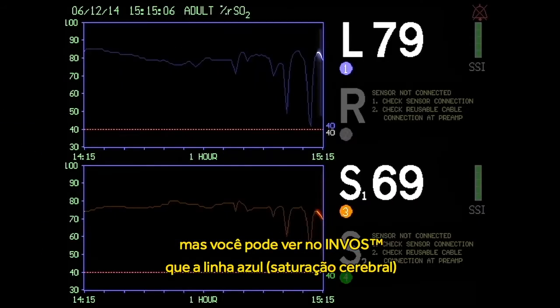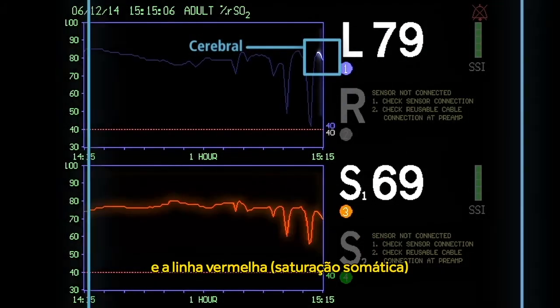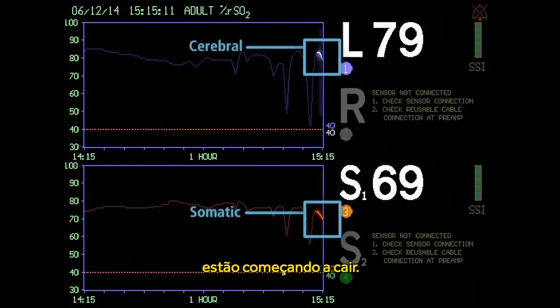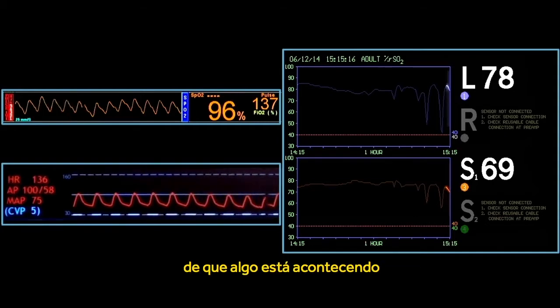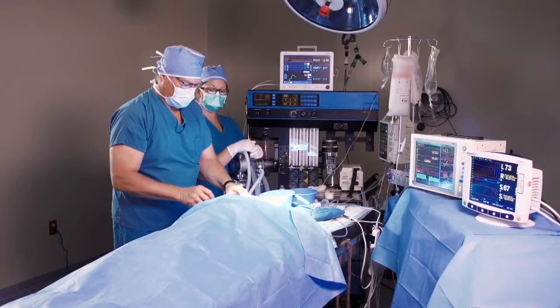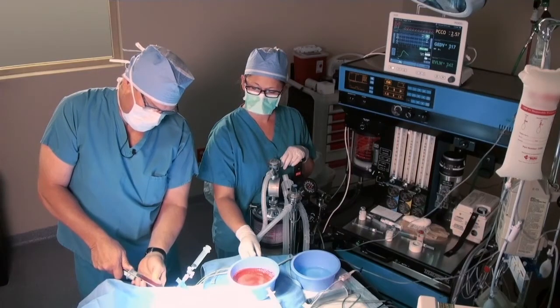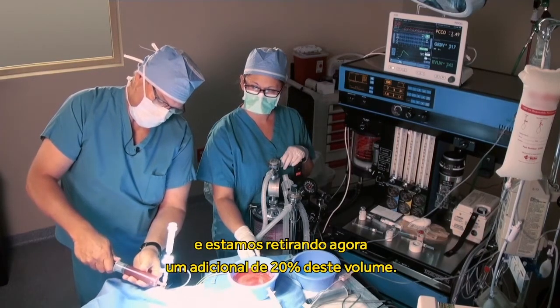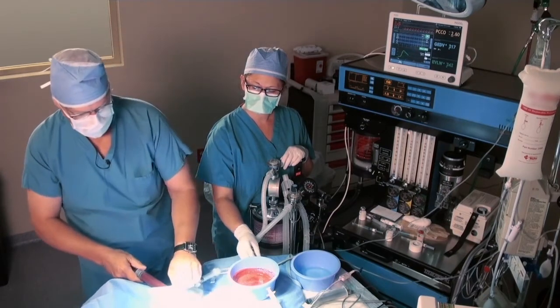And you can see that both the blue line, which is the cerebral saturation, and the red line, which is the somatic saturation, are starting to go down. I still have no other clinical indication that something is going on. Okay, so I have now removed 20% of the patient's blood volume. Now we're going to remove an additional 20% of the blood volume. Okay, there was another 60.